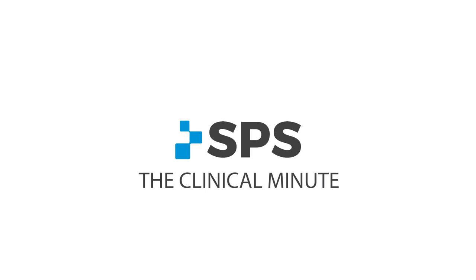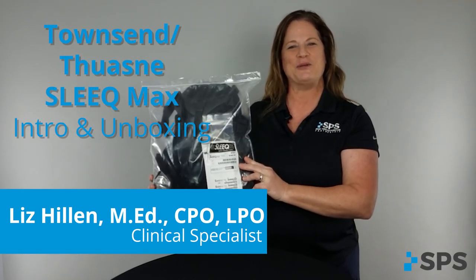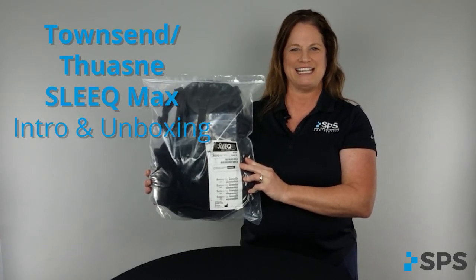Hi, I'm Liz with SPS. Welcome to the Clinical Minute. In this segment, I will review the Townsend Thuasne SLEEQ Max TLSO.